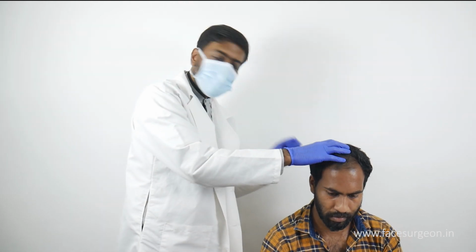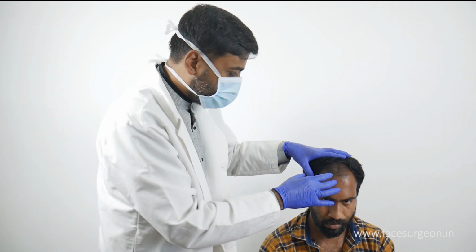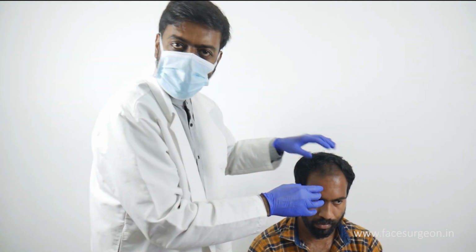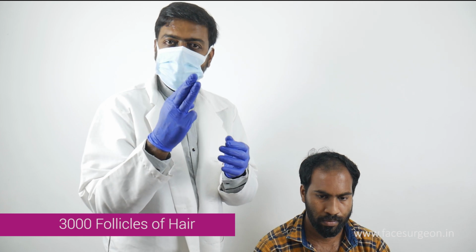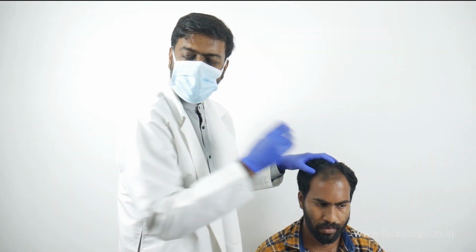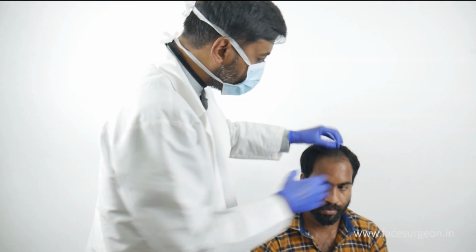Each follicle from behind is taken. The single follicles, we like to keep at the front row to make it look natural and to blend, and the multiple grafts, that is, some hair follicles have 2-3 roots in them, we call multiple grafts. We harvest these multiple grafts and stack them up behind for the density. So that's going to be the key for this particular guy.